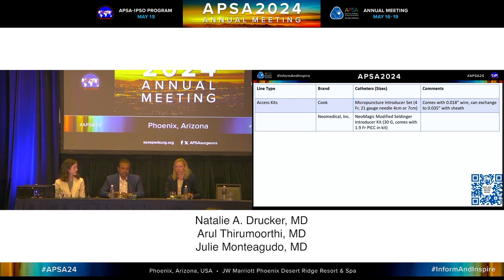So we talked about it, and one of the things is when it was informal polling discussion, a lot of people are not comfortable doing facial vein, even on older, larger children. So trying to translate that experience, even for our audience here, it's uncomfortable. It's one of those things that's becoming a lost art. It's actually something that we're talking about and investigating a little bit further. I have to be honest, I haven't done a facial vein cut down in, I guess, 7, 8 years. That's the last time I did one. And I'm trying to think through if I've ever taken a fellow through it myself.